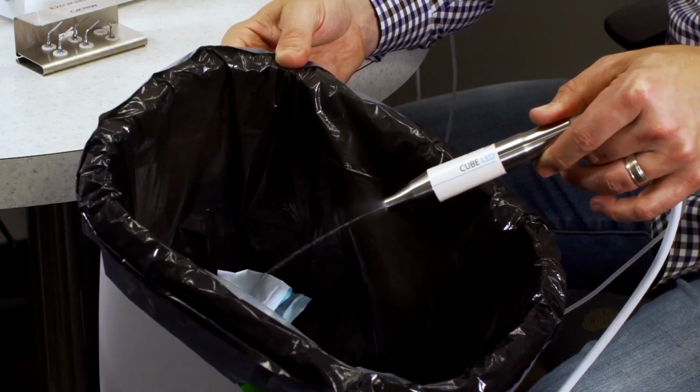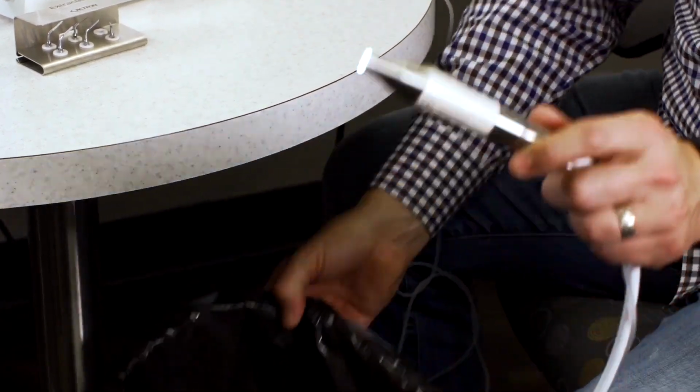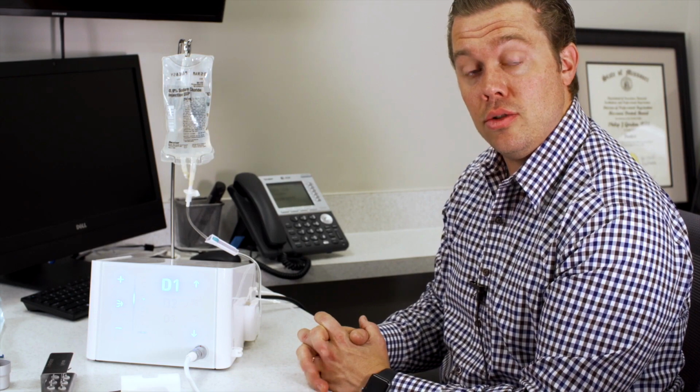It's got a high output of water that runs through the handpiece here. You want to keep copious amounts of water for cutting so that you're not burning the bone.